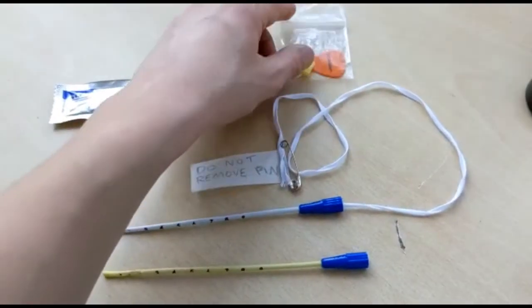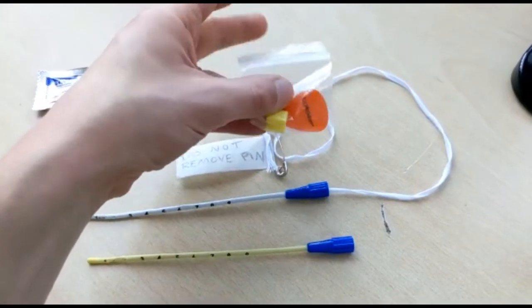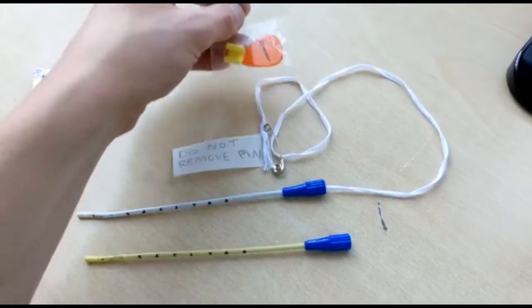The clip provided can be used to secure the bridle string to the NG tube. The clip alone is not enough to secure it and the string will need to be tied as well.